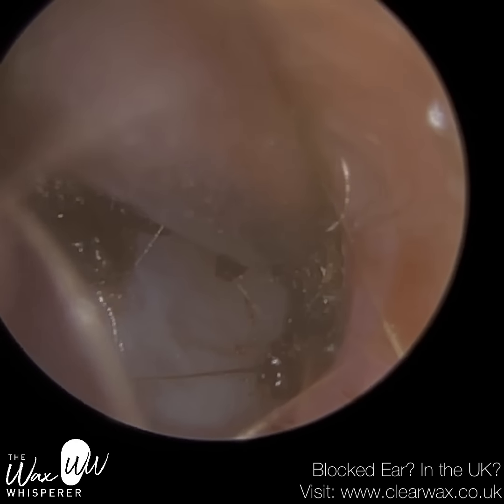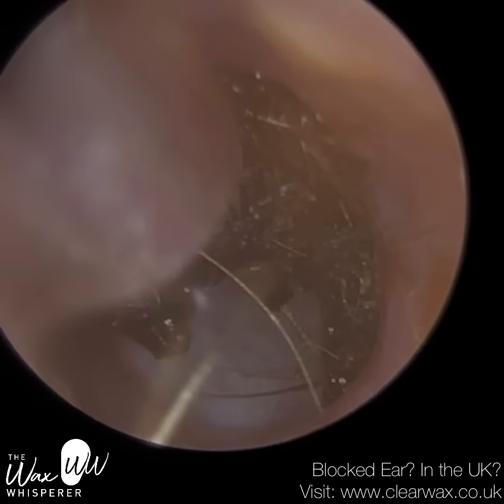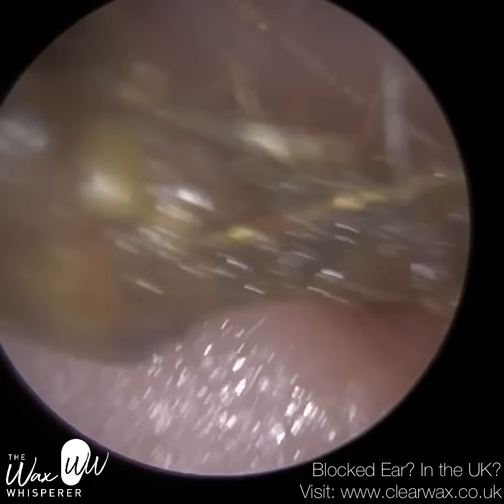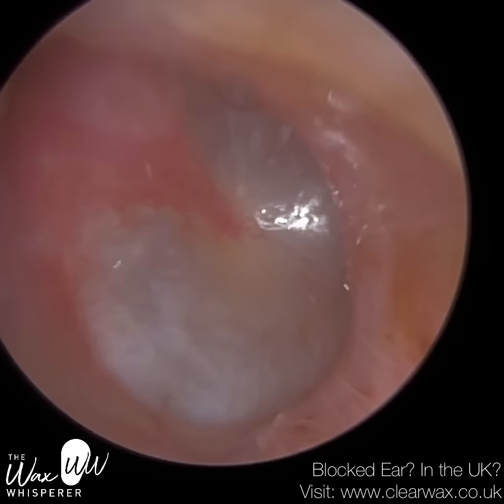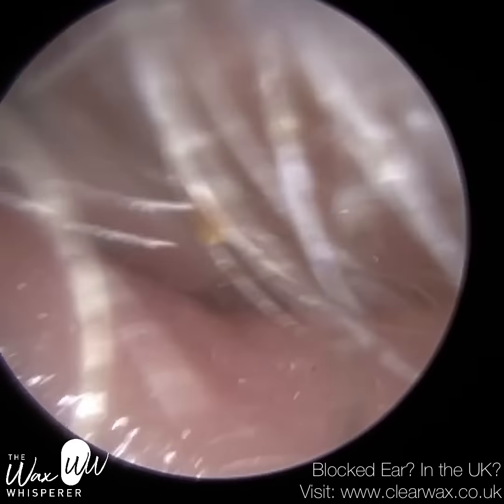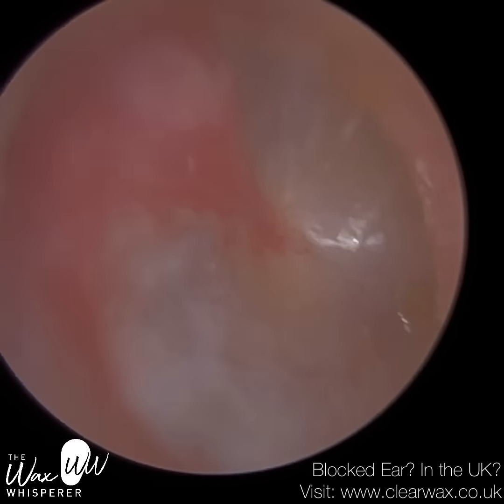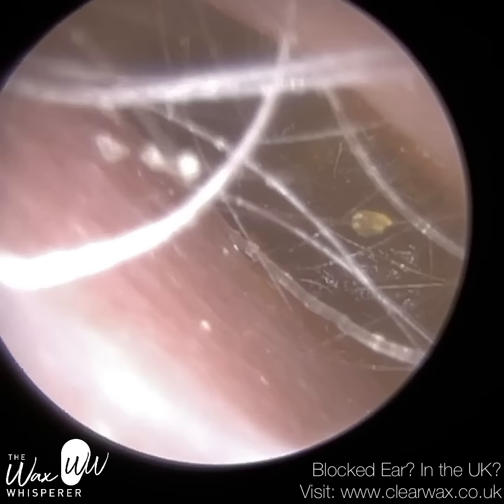I've just got back in with the full Zollner suction probe, going to the roof of the canal. Now with that additional power I'm bringing it down and away — I've managed to loosen it and it's now coming out of the ear. The more lateral midsection of the ear canal had quite soft and mushy wax, whereas the medial aspect towards the eardrum was a lot more crusty, dry, and large. You can see how narrow and collapsed the patient's ear canal is — I've had to stretch it open just to insert the endoscope. We've successfully cleared their right ear.